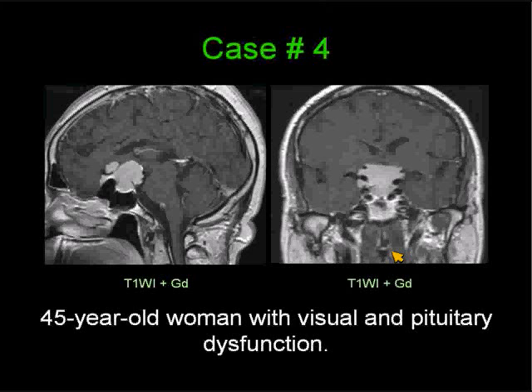Case number four: a 45-year-old woman with visual and pituitary dysfunction. You are shown a slightly off-midline sagittal post-gadolinium T1-weighted image on the left, and on the right a coronal T1-weighted image following gadolinium administration. I'll give you a couple of seconds to look at the findings. You should be able to suggest not one, but perhaps 10 differential diagnoses in this case.